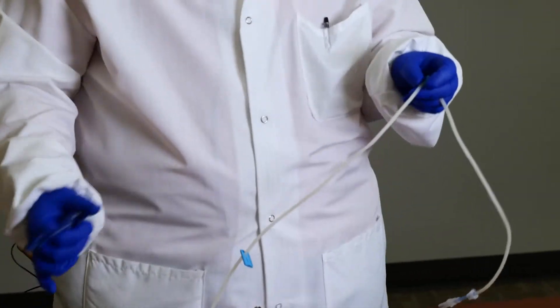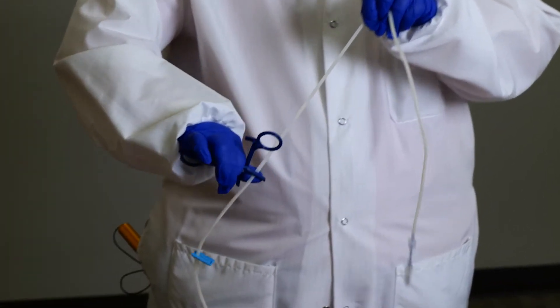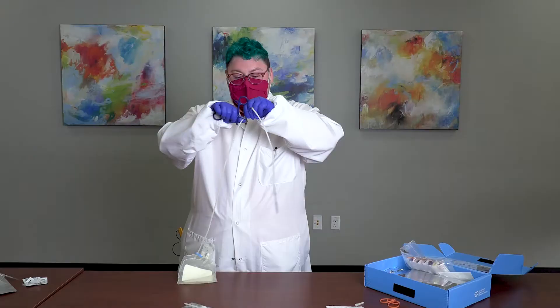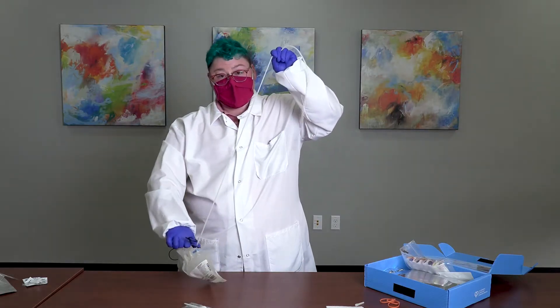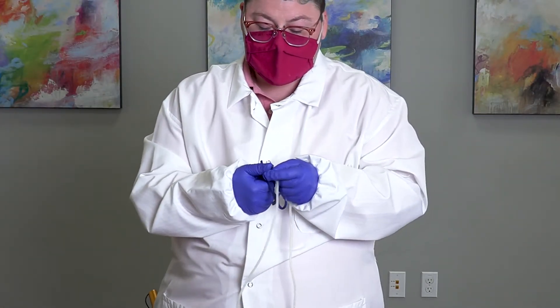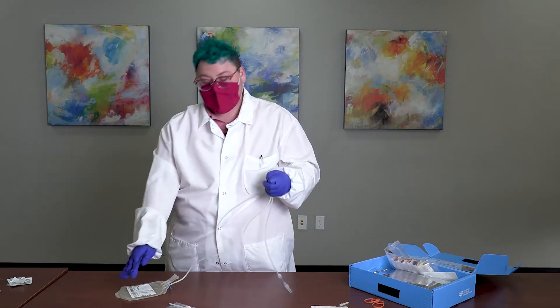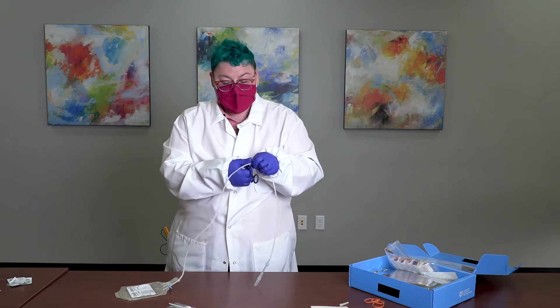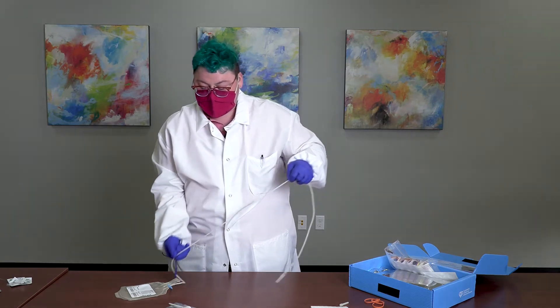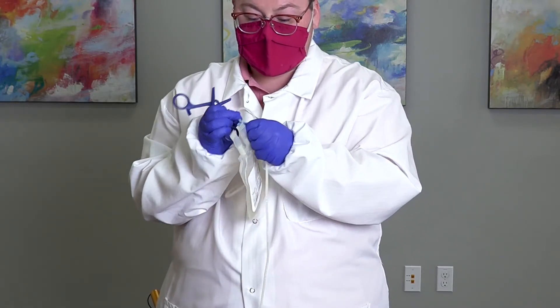The next step is to strip the tubing. The reason for this is to mix the anticoagulant in the bag with the blood in the tube and ensure every last cell gets from the tubing into the bag. To strip the tubing, take the hemostat against your thumb and slide it across — this is similar to curling a ribbon. We recommend doing this twice. It is okay if the blood goes back into the tubing line, but on the last pass, go ahead and keep it there. Slide the second blue clamp along the tubing line to seal it.